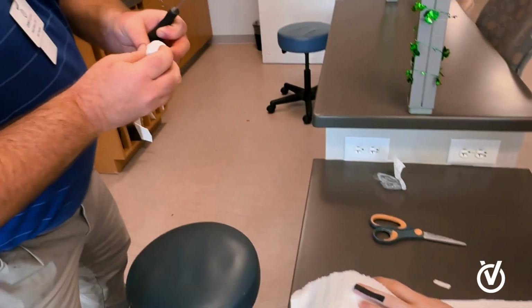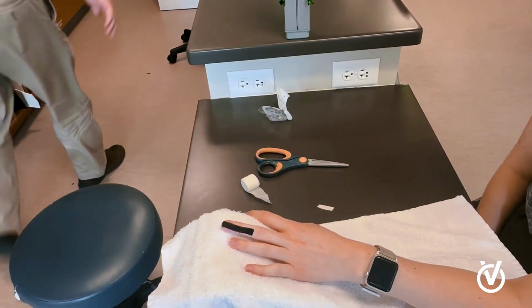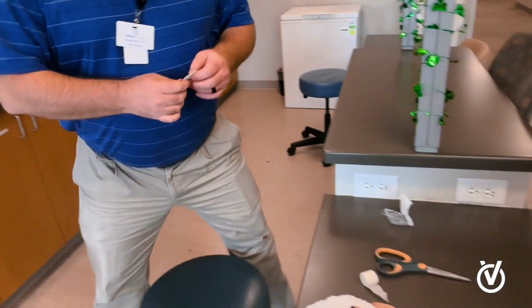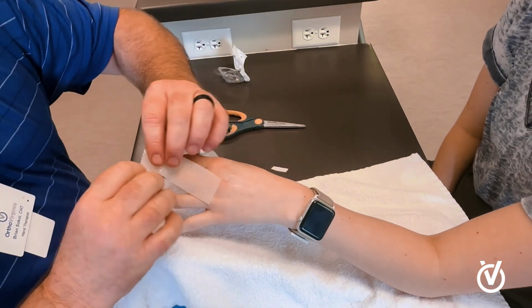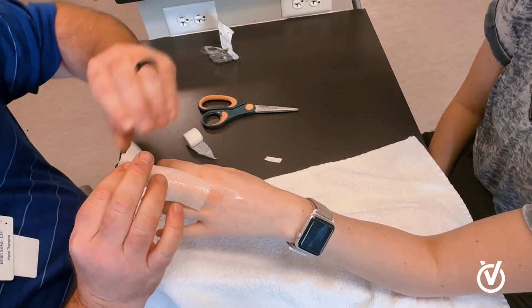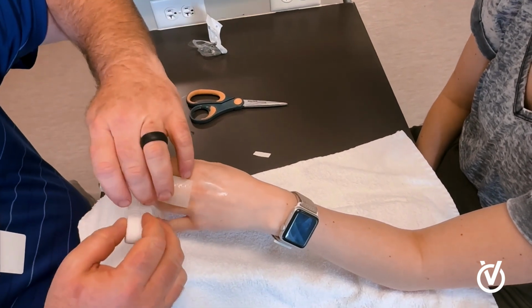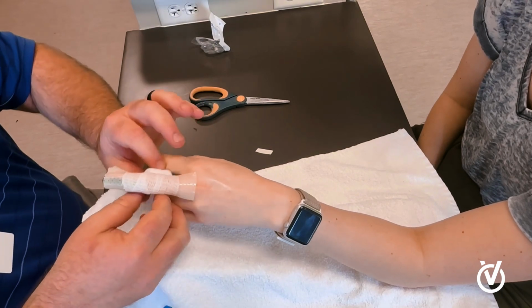Allow it to heat up. I make sure I have a roll of 1-inch gauze, because this is the little trick that really helps me to do it. So, I start by laying this on the top of the finger. I wrap around P3. I secure that part. Then I take my gauze and I go ahead and wrap this around the finger like that.